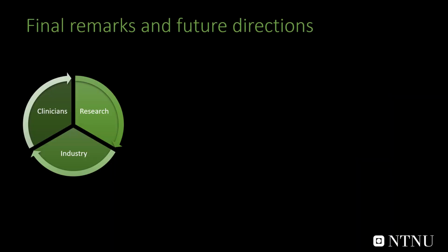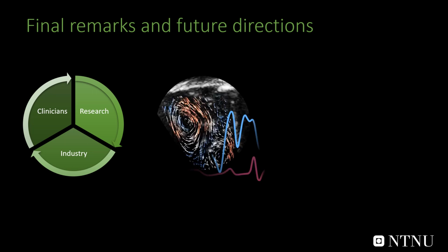For the final remarks and future direction, I would like to first emphasize that echocardiography continuously benefits from technical development in the research community and the industry. The growing ability to handle large amounts of data simultaneously in the clinical scanners paves the way for implementing and testing high frame rate imaging techniques in clinical settings. It is a time for innovation. We have seen that vector flow imaging can improve the visualization and measurement of intracardiac flows, but the clinical value remains to be established. Several challenges still need our attention.